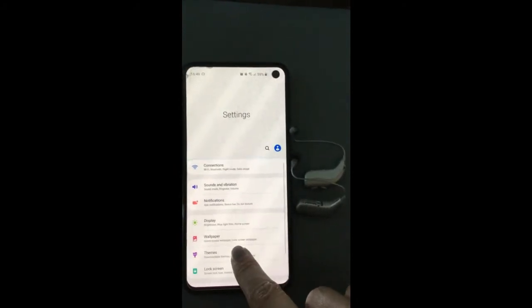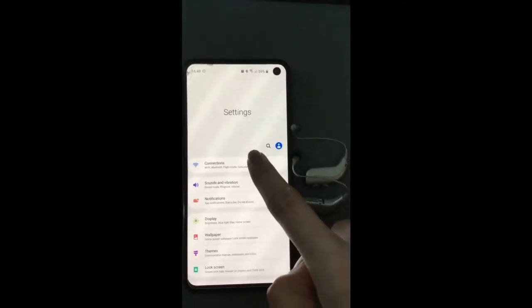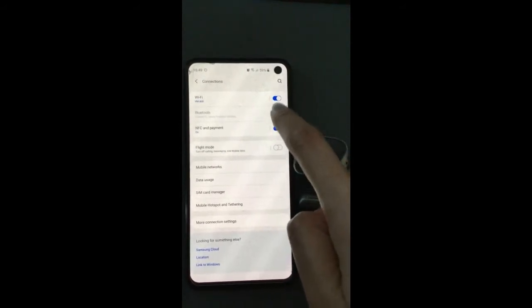First of all, what we need to do is go to our phone settings, go to connections, and check that the Bluetooth on your phone is turned on.